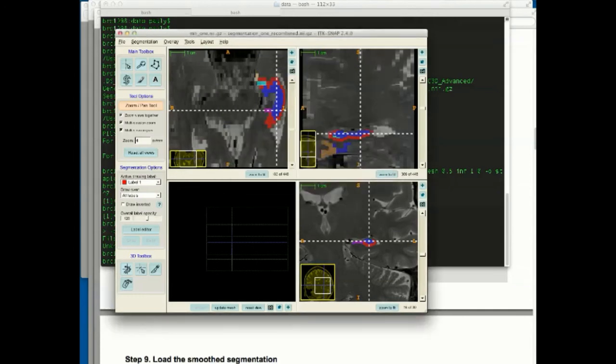You see that? That's because we have different colors assigned to different labels, and what the vote did was there is no more 13. 13 got assigned a different color because now it's 10. So that's something to keep in mind when you're using these, and then probably using statistics of overlaps and volumes of each label. Labels can get reassigned by mistake if you're not careful.